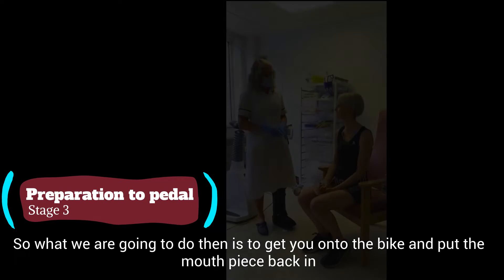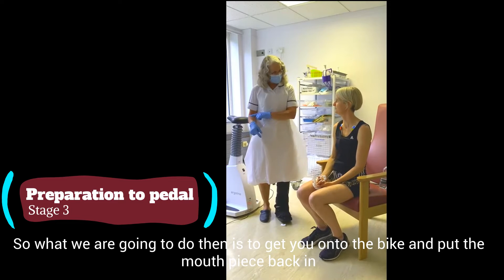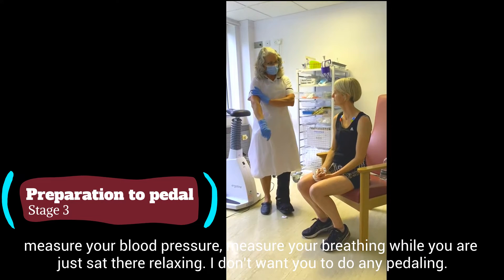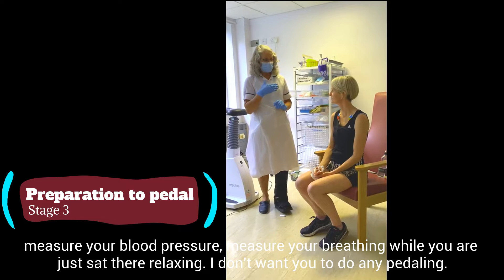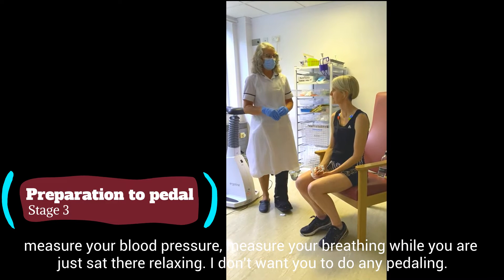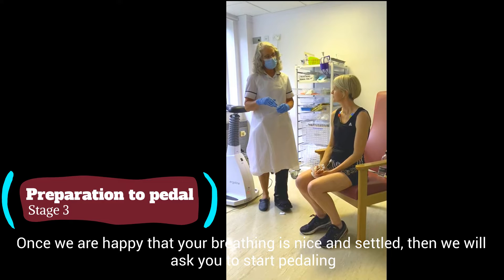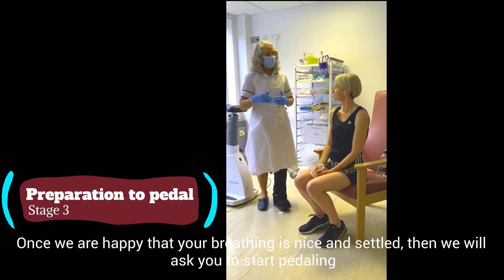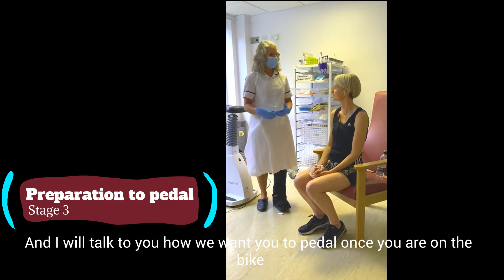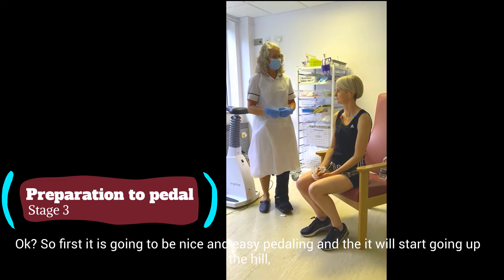So what we're going to do then is get you onto the bike, and then put that mouthpiece back in, measure your blood pressure, and measure your breathing while you're just sitting there relaxing. I don't want you to do any pedalling yet. And then when we're happy that your breathing is nice and settled, we'll ask you to start pedalling. I'll talk to you about how we want you to pedal once we've got you on the bike.